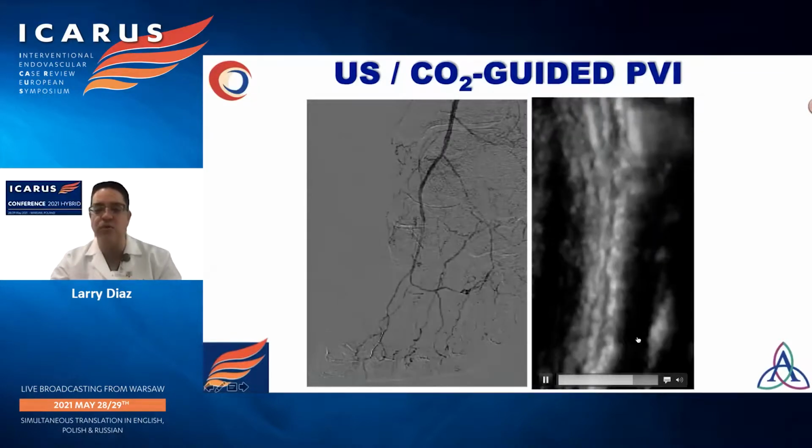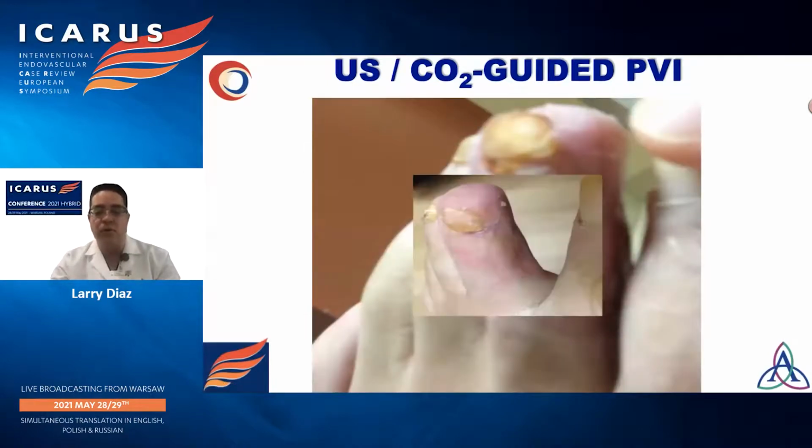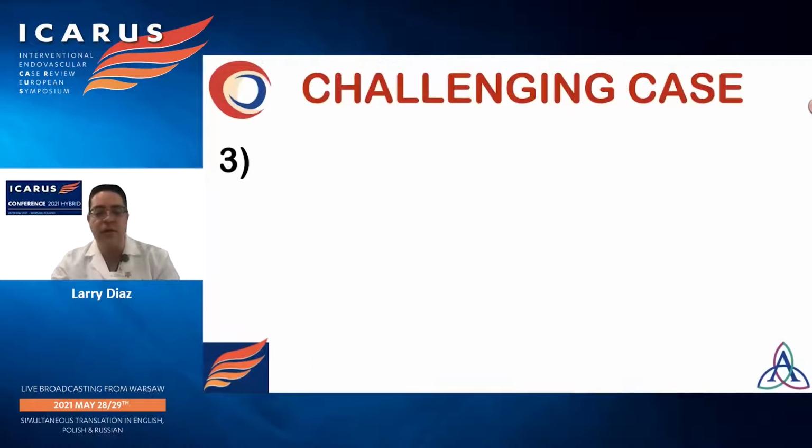That's how CO2 and ultrasound allow us to do these interventions. This was the original wound. A month later, it was completely healed.